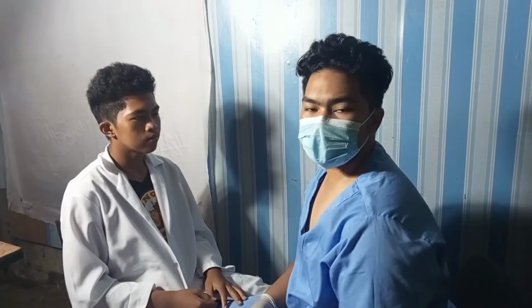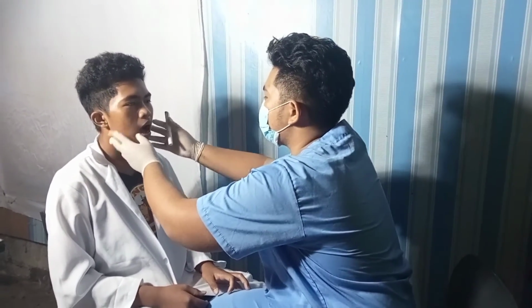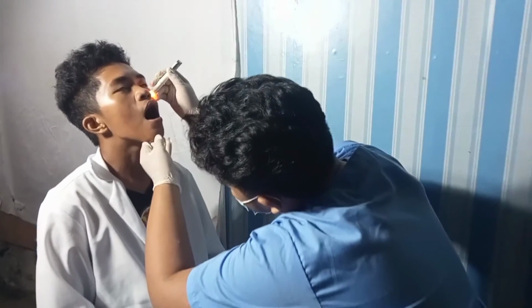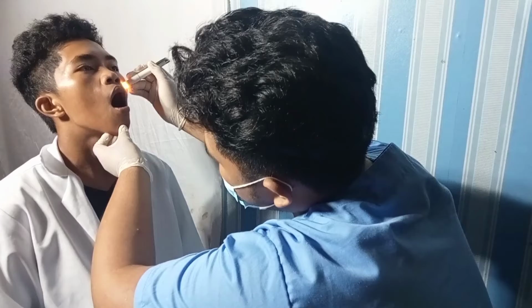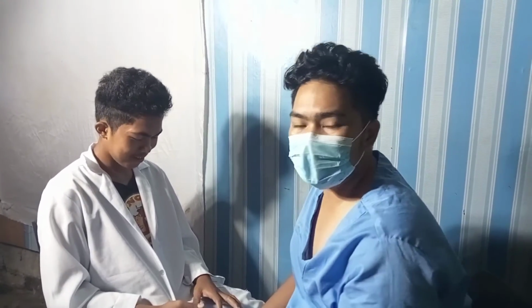To further test the sinuses of the patient, we need to trans-illuminate the sinuses of the patient. Sir, can you open your mouth wide po and tilt your head? So as we can see, the light goes through the inside of the mouth of the patient, which is a good sign, and there are no signs of pus or fluids in the sinuses of the patient.